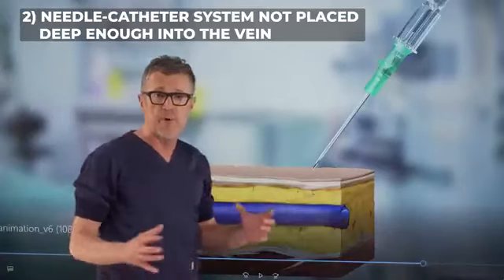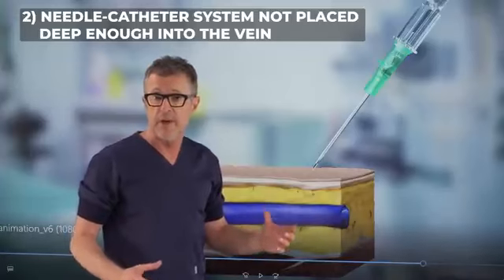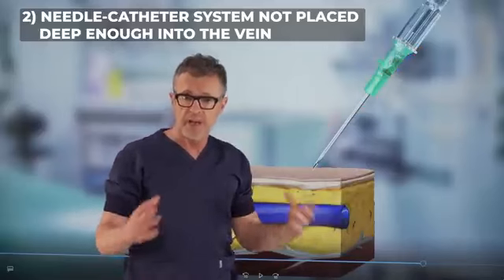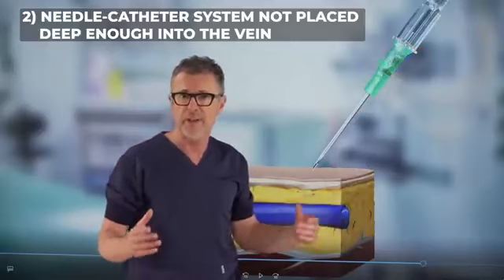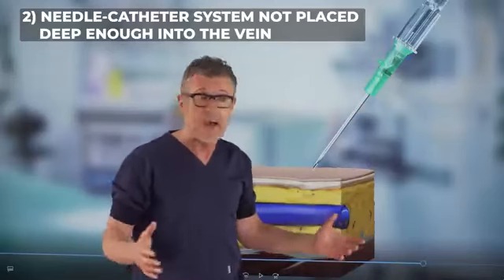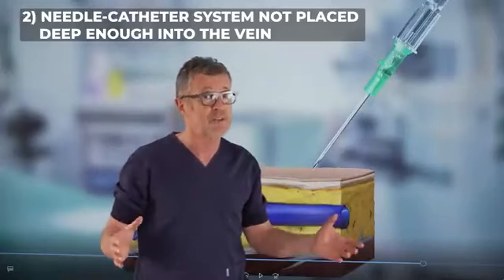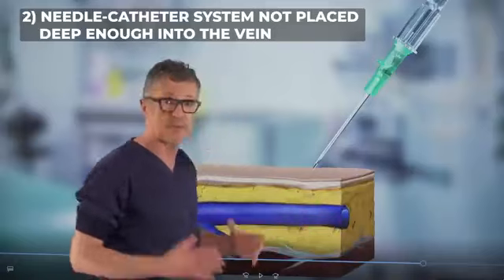That is one of the most common mistakes that you see all the time. As soon as the flashback appears, the operator is happy with the position and tries to feed the catheter over the needle, whereas in fact, you should advance it deeper inside the vein to make sure that there is enough slack and that the catheter is inside the vein as well.